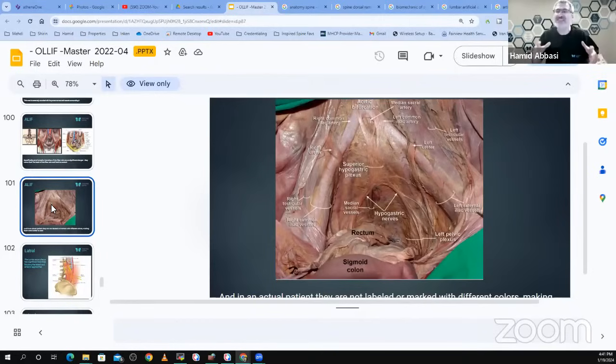Now you go there, everything is baked like a scar, and the vessels and the nerves are indistinguishable. And going back there after a first surgery to take that thing out is an almost deadly surgery. Revision surgery for lumbar disc replacements, if something bad happens and you need to go back in there, is very, very scary. And that's probably one of several reasons why there's not a lot of excitement about lumbar disc replacements. But there is a group of patients that do very well with lumbar disc replacements, probably better than they would do with a fusion.